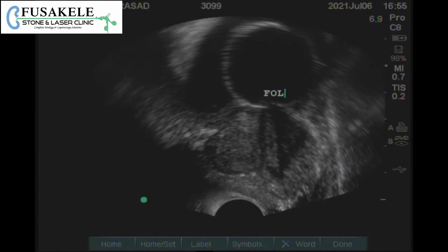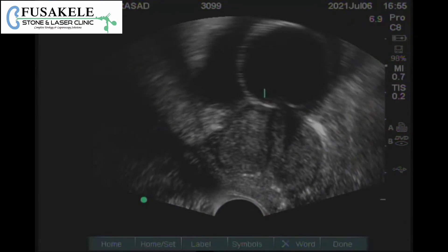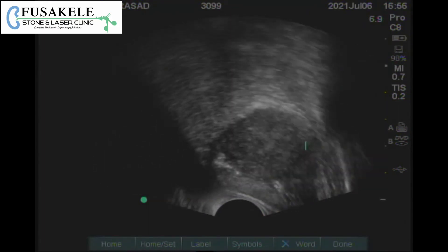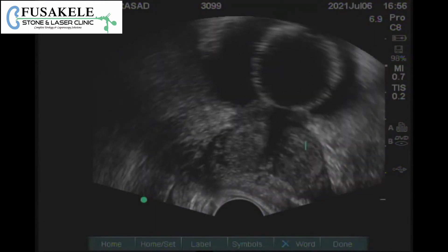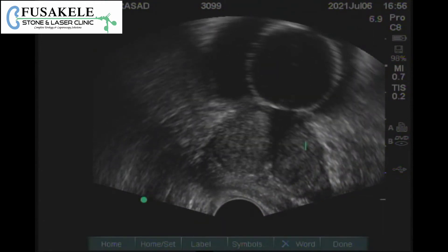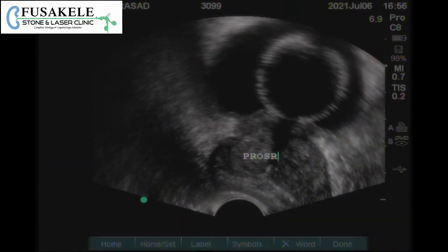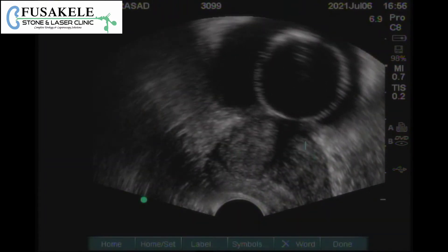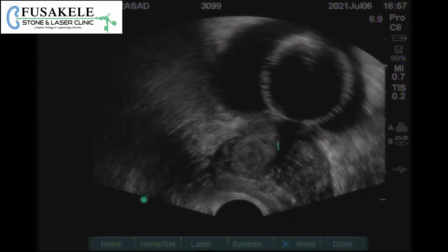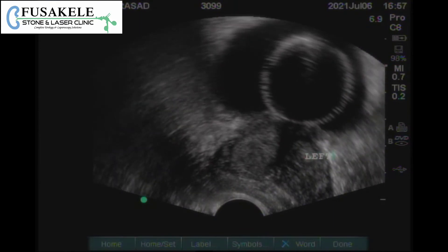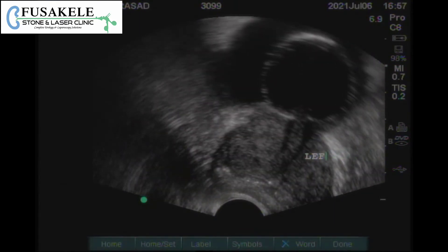Then the prostate is seen. In the axial section, we can see the good zonal anatomy of the prostate, where both lobes and the urethra are visible. This is the right lobe of the prostate, this is the transitional zone, this is the urethra, and this is the left lobe of the prostate. We can also very well see the peripheral zone.